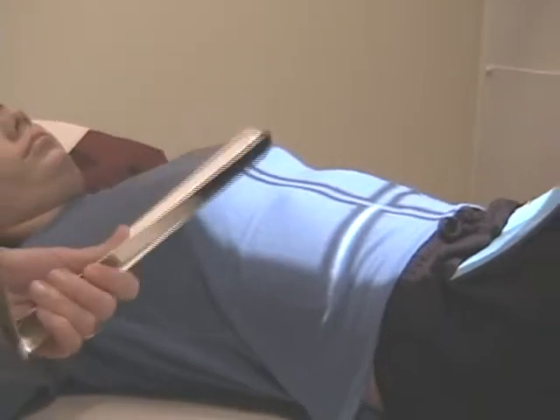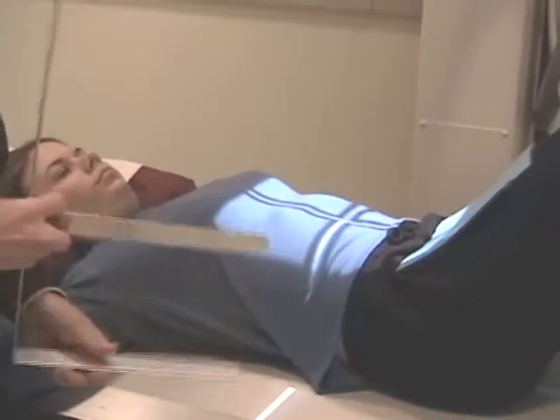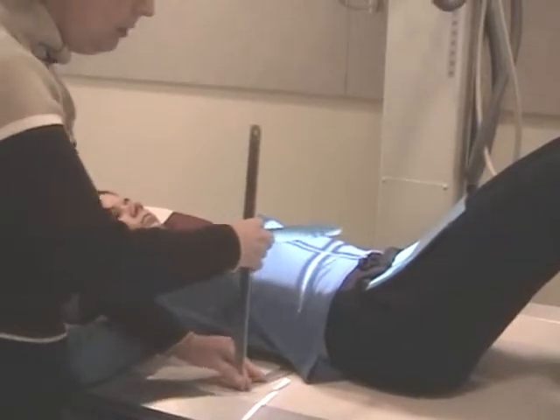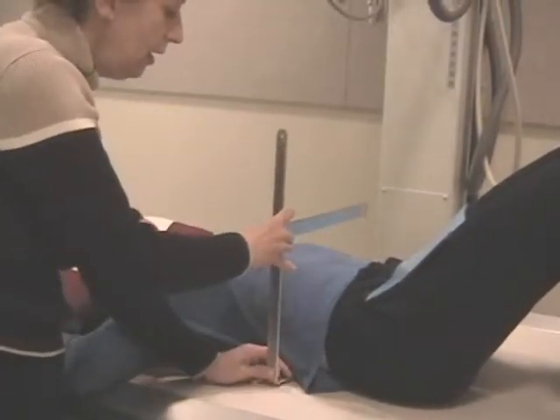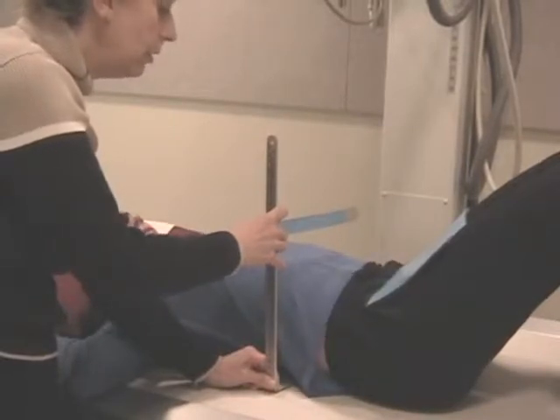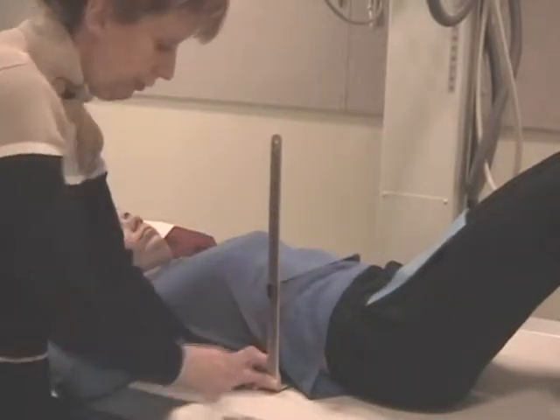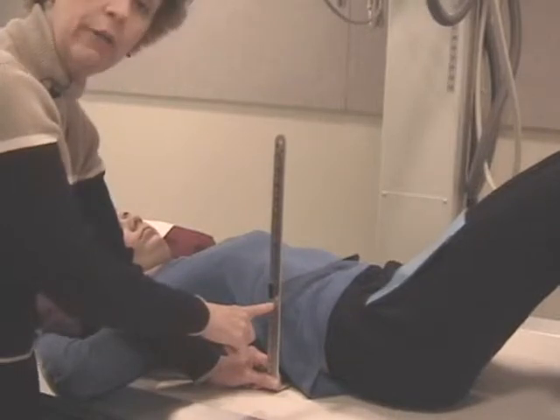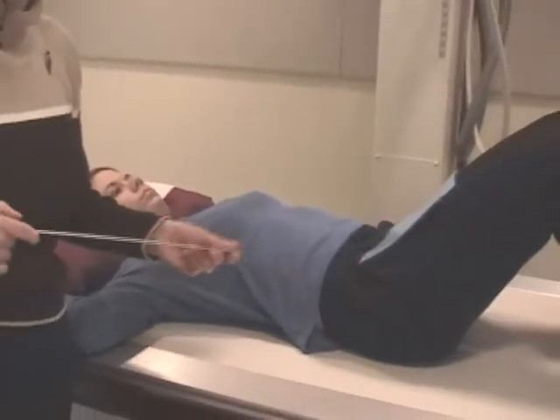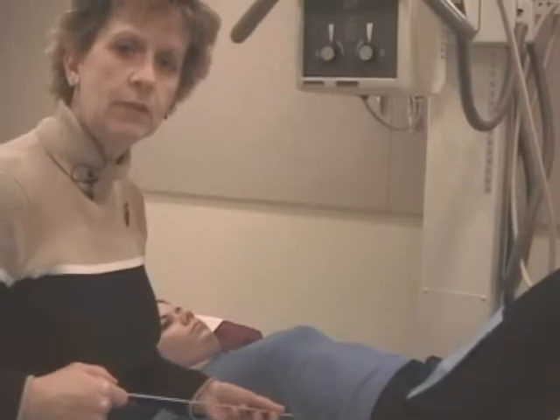If you are not photo timing, if you're not using automatic exposure controls, you will want to use the calipers. And you come in right where the central ray is, and you have your patient take a breath in, blow it out, and then you measure and look up on the chart, lumbar spine, AP. This says 17, so I'd actually look on the chart for 18. If you'll recall, most of them are set up in 2 centimeter increments.